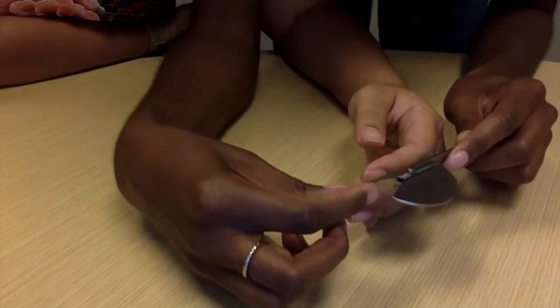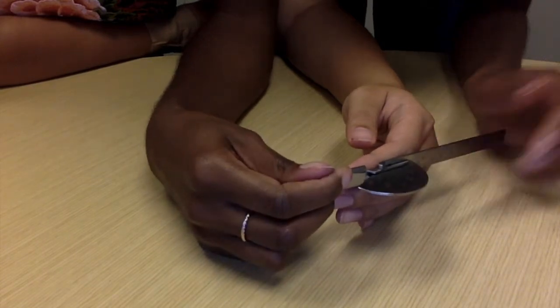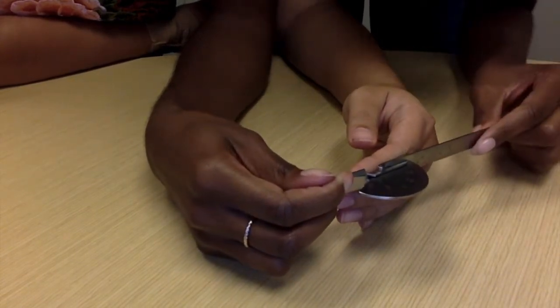For DIP flexion, the normal range is 0 to 80 degrees. The patient is seated with the forearm in mid position, the wrist at 0 degrees neutral deviation, and the forearm and hand supported on the ulnar border on a firm surface. The axis is on the dorsal surface of the distal interphalangeal joint. The stationary arm is placed over the middle phalanx, and the movable arm over the distal phalanx.